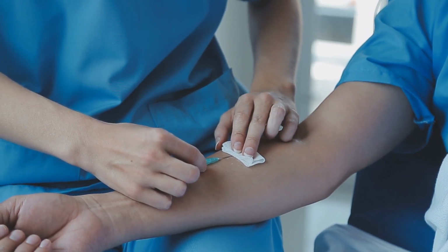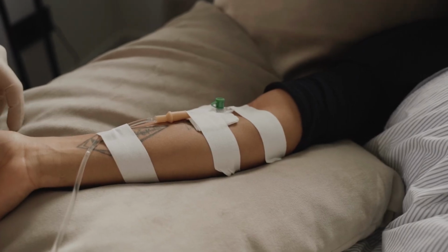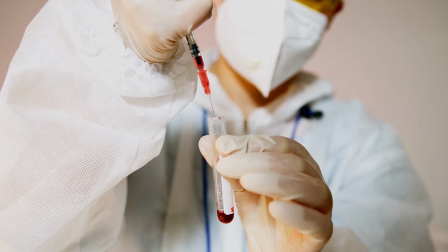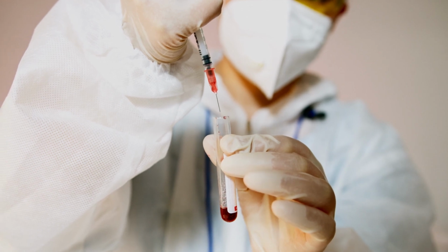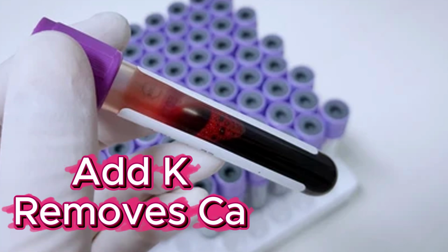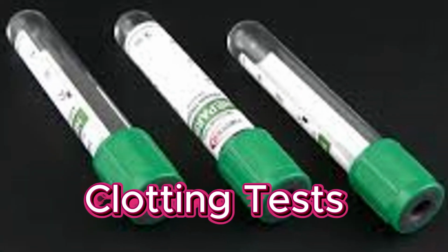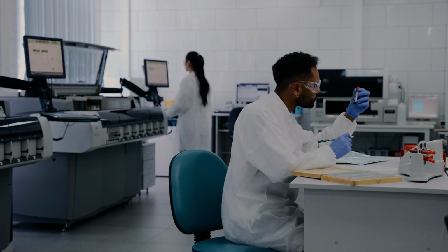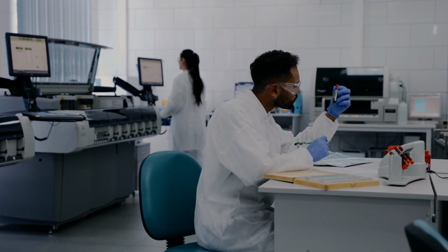The science behind additive carryover. When we draw blood, the needle and tubing can retain small amounts of additive from one tube to the next. Even a few microliters can alter test chemistry. For example, EDTA adds potassium and removes calcium. Heparin interferes with clotting tests. Citrate dilutes plasma. That's why the Clinical and Laboratory Standards Institute gives a fixed standard order of draw that must be followed globally.